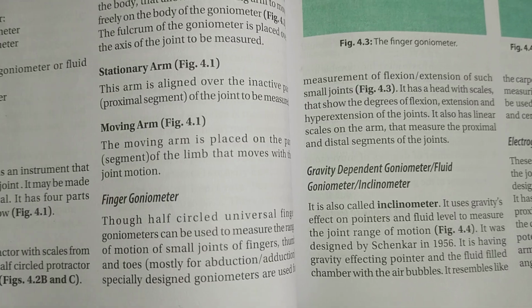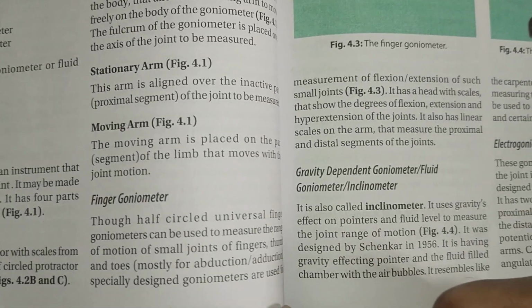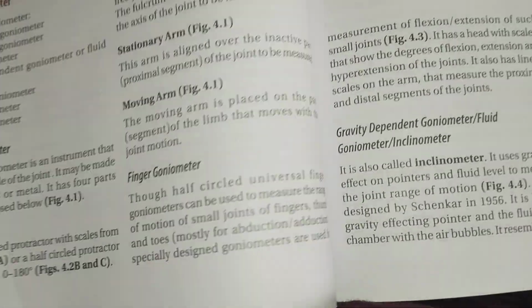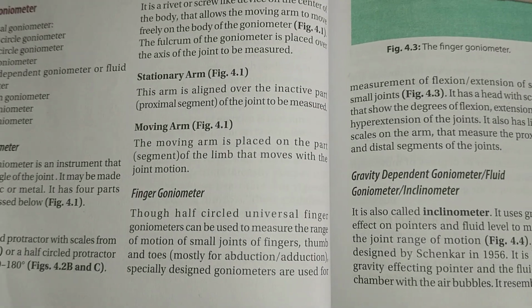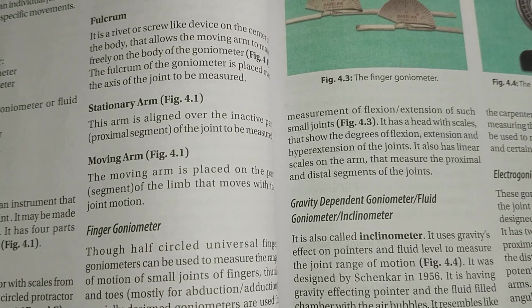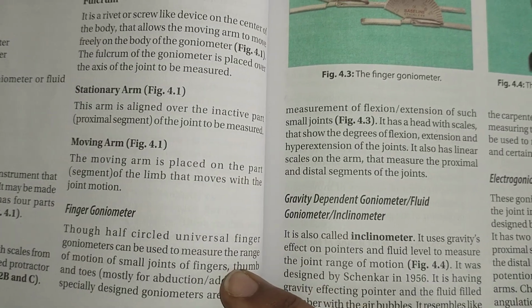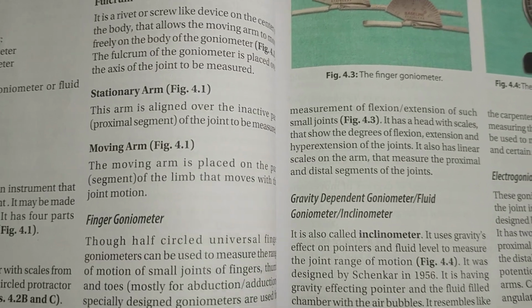And the next one, finger goniometer. Half circled universal finger goniometers can be used to measure the range of motion of small joints of fingers, thumb and toes, mostly for abduction, adduction. Specially designed goniometers are used for the measurement of flexion, extension of such small joints. Finger goniometers can be used for the small joints like fingers, thumb, toes.